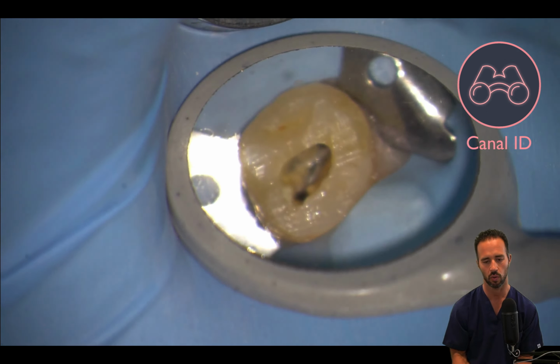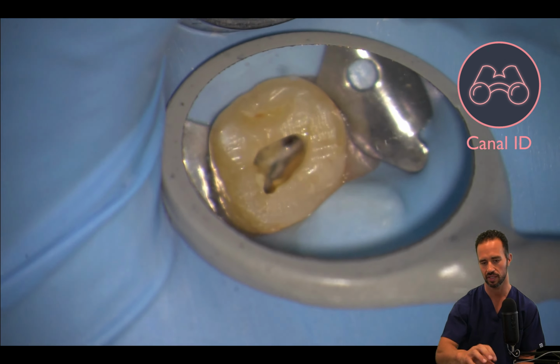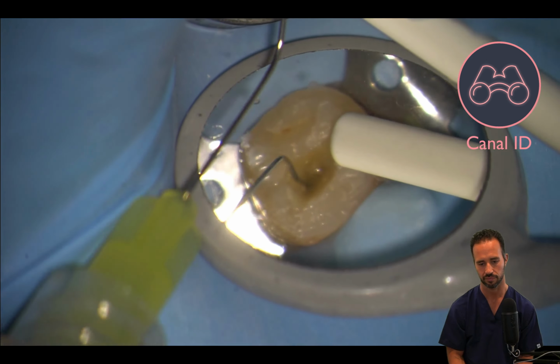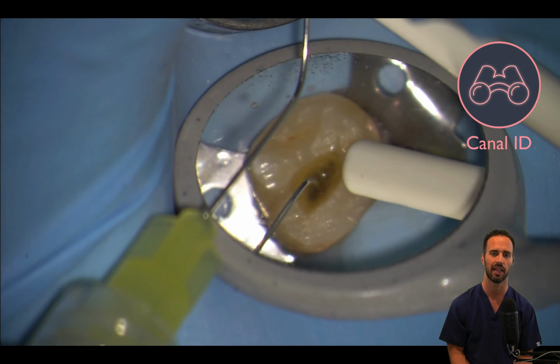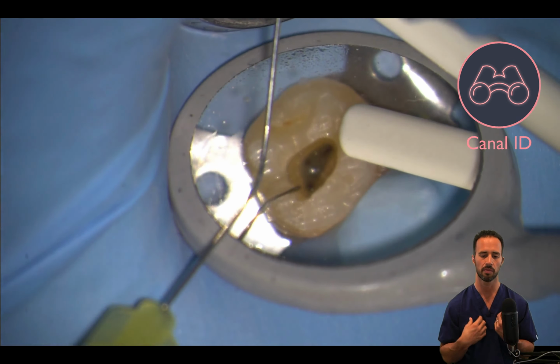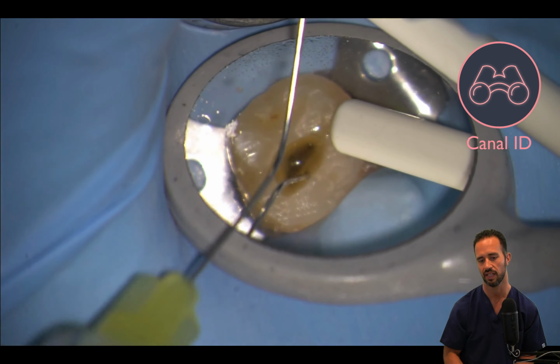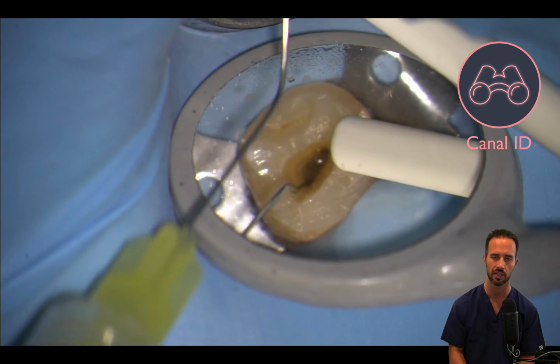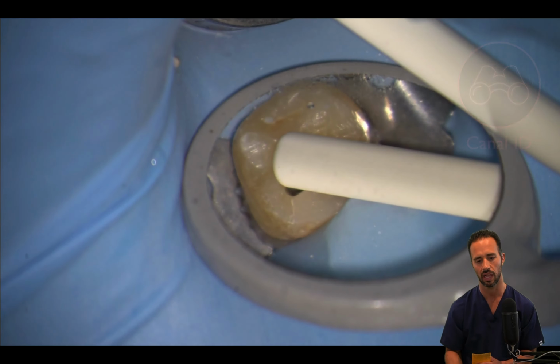So we got the orifice opener right into the MB, and we can see the three main canals are all present. And the little tip that I'd like to pass along to you is, I generally instrument all my main canals initially before I even start the search for my MB2. And I do that for a lot of reasons.